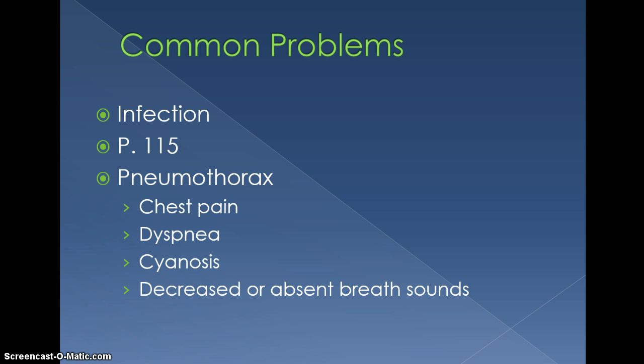One of the common problems is a pneumothorax, and it's the most common traumatic complication of catheter insertion, especially into the subclavian or internal jugular vein. It's usually discovered via x-ray that confirms that the catheter is not where it's supposed to be, even if the patient does not have immediate symptoms. So that's again another important reason to have an x-ray as soon as the device is put in. It could be a very minute pneumothorax and may not require any intervention.